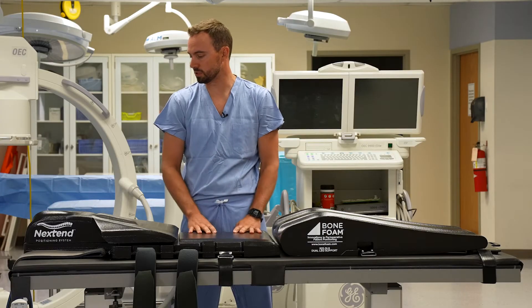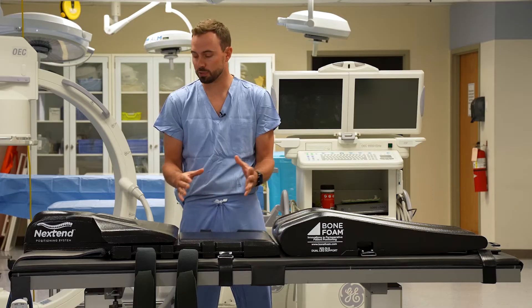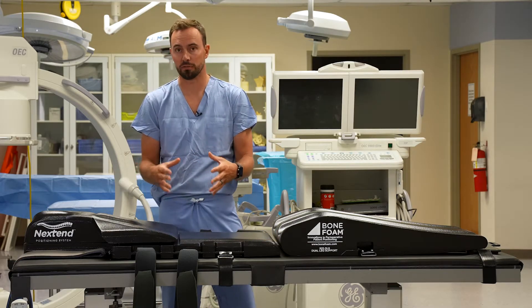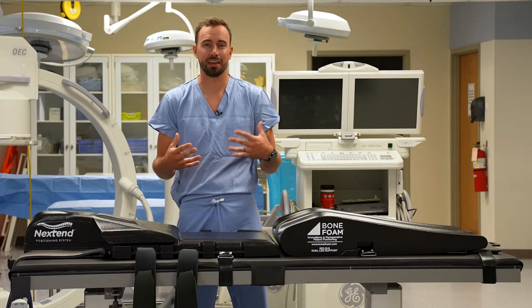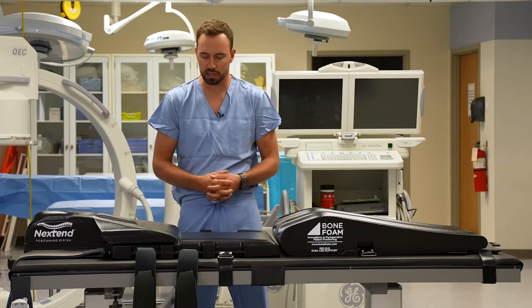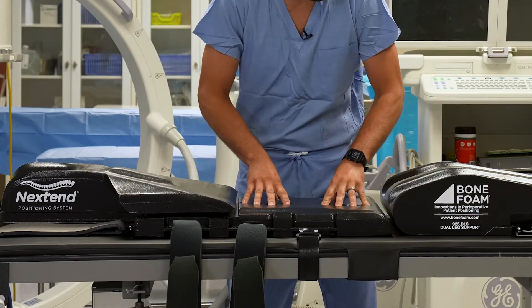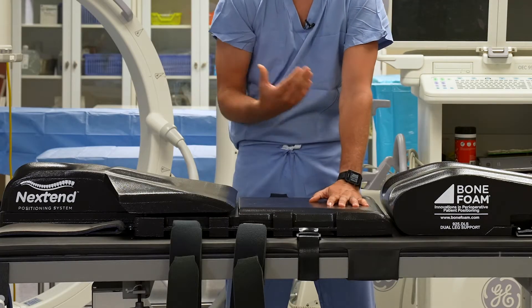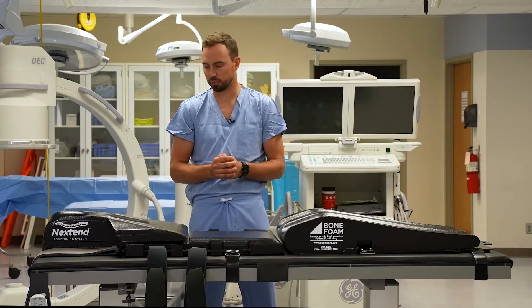This is our Nextend positioning system, designed for patient positioning for ACDF procedures, or anterior cervical discectomy and fusion. It is a universal tabletop positioner designed to be used on — most commonly — a Jackson table or potentially a ProAxis table, depending on what table is at the spine facility. It's a tabletop padding, so typically you'll take off the normal padding on the table and this will replace it. There's Velcro on the back that will stabilize it in place.